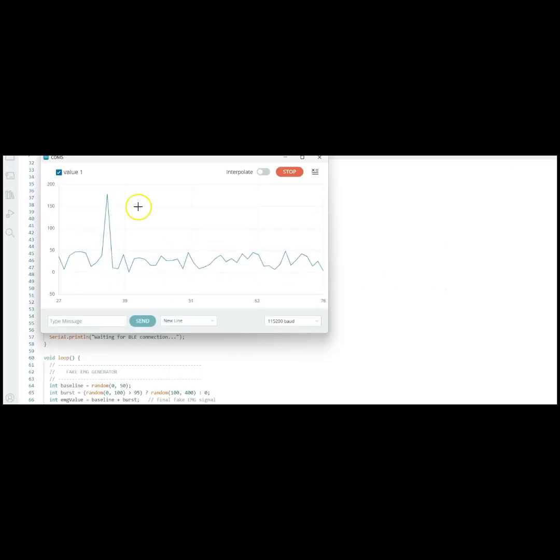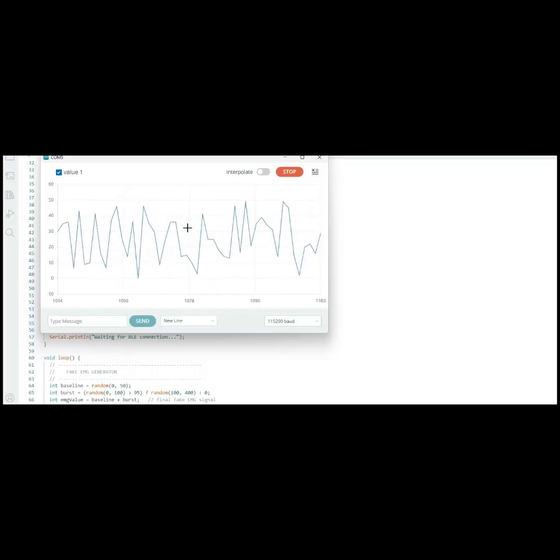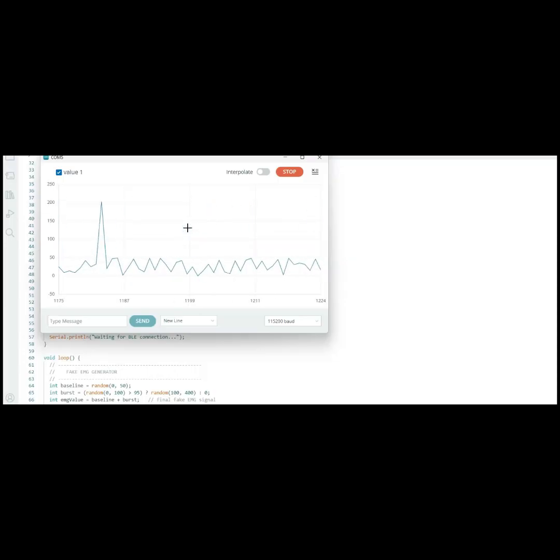In the loop, we begin the serial monitor. We have the serial monitor also display how the EMG signals will look. This information is being sent to the MIT app, and from this we are generating a chart. Since it's continuous in the MIT app, we only get a few points at a time, and the user can generate a new graph whenever they press the button.